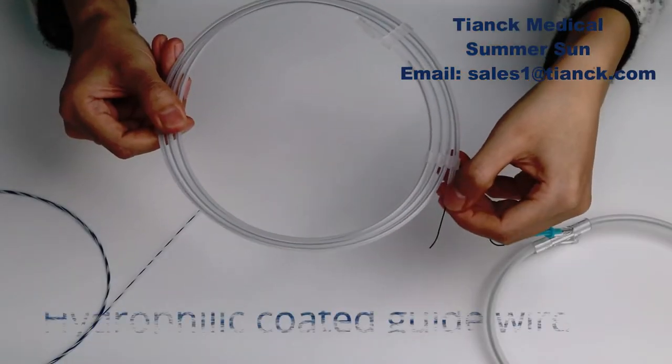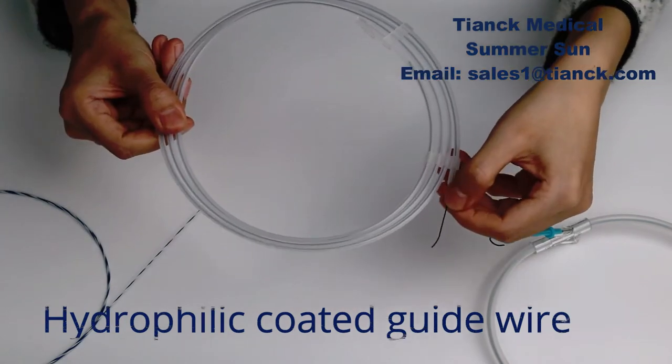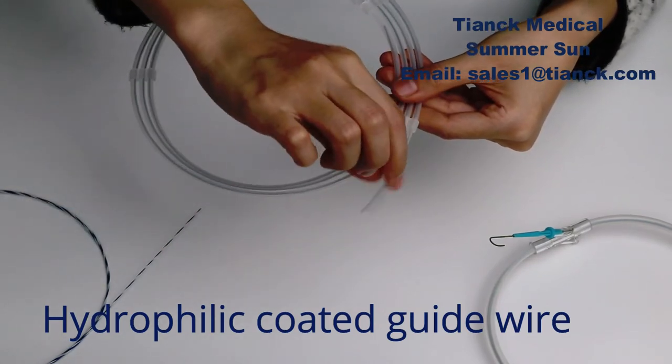Hydrophilic guide wire is a guide wire coated with hydrophilic polymer. It attracts water, making the delivery smoother but with less tactile sensation. The tip is soft, effectively avoiding tissue damage. The shaft can provide strong support.